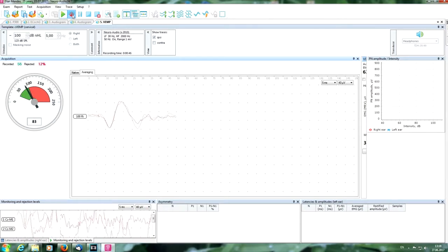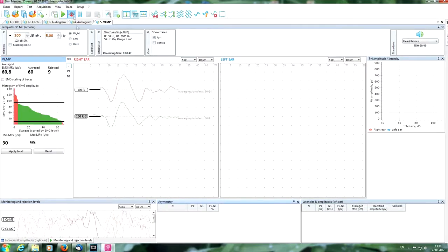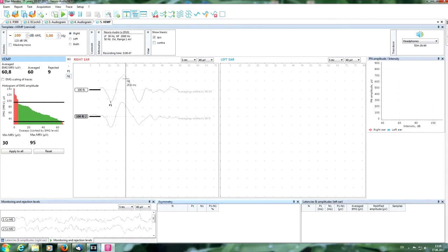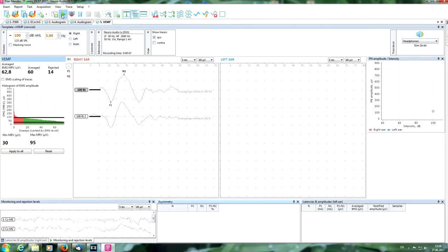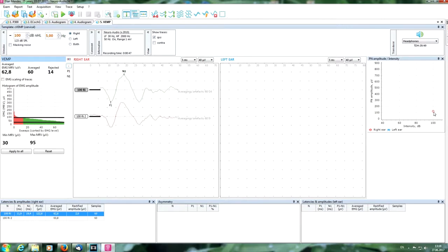Okay, now we can put the necessary markers. P1 positivity is oriented downwards in our montage scheme. Here in this table we can see the latencies and amplitude of responses, as here in this graphic.